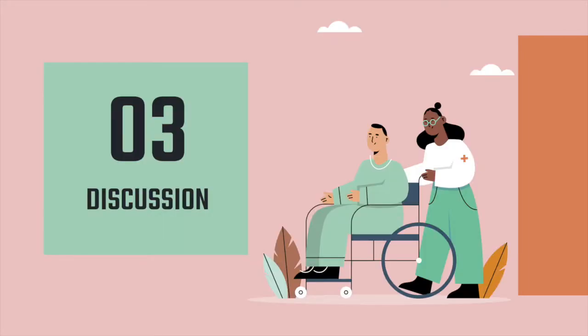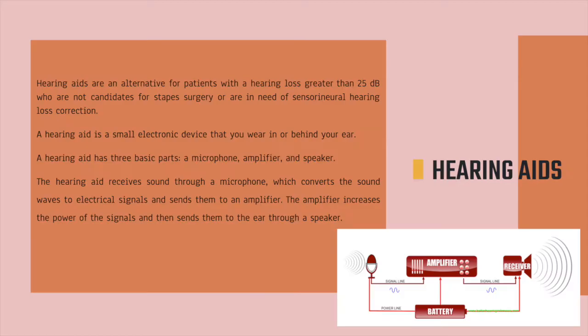Hello, my name is Yovita and I'm going to explain about hearing aids. Hearing aids are an alternative for patients with a hearing loss greater than 25 decibels who are not candidates for stapes surgery or are in need of sensorineural hearing loss correction. Many otosclerosis patients use hearing aids to help with their hearing loss.